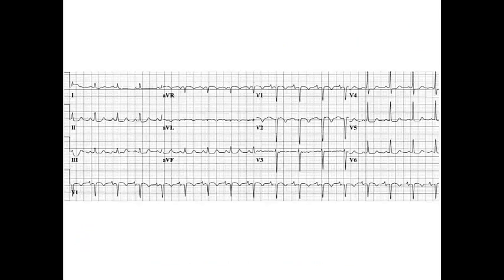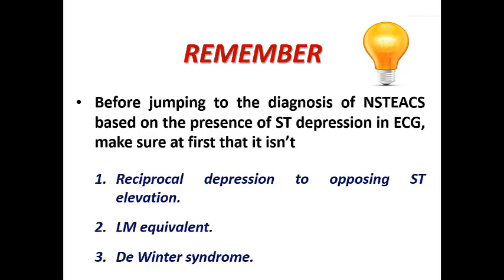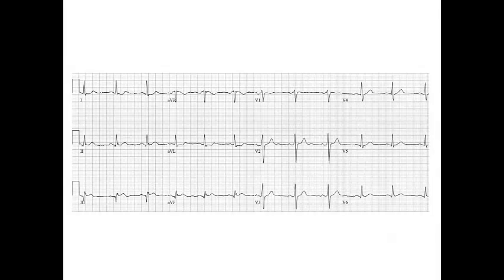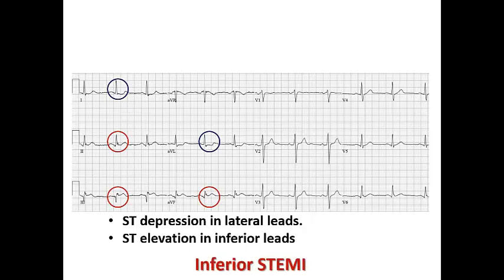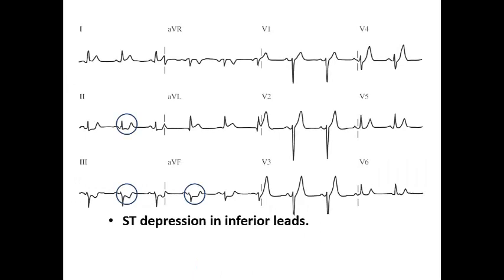Looking at this ECG, we can see ST segment depression in V4, V5, and V6, and also in leads II, III, and AVF — minimal ST depression in a patient presenting with chest pain, which may indicate non-ST elevation acute coronary syndrome. But before jumping to that diagnosis based on ST depression, make sure it is not reciprocal depression to opposing ST elevation, not a left main equivalent, and not DeWinter syndrome. For example, this ECG shows ST depression in lateral leads that appears to suggest non-STEMI — but there is actually ST elevation in inferior leads, indicating inferior STEMI.